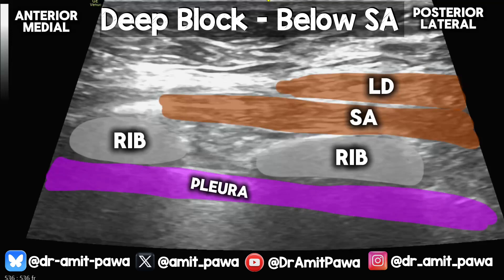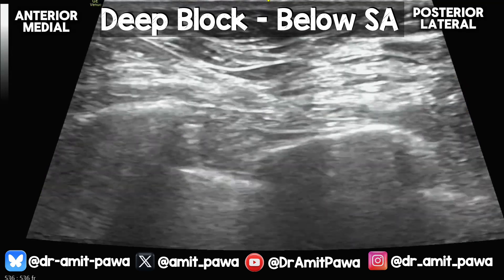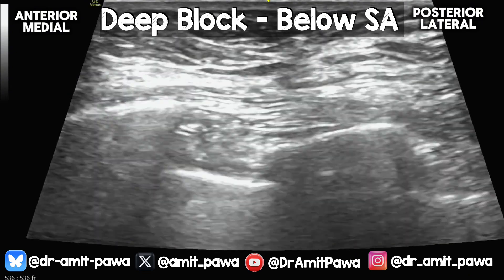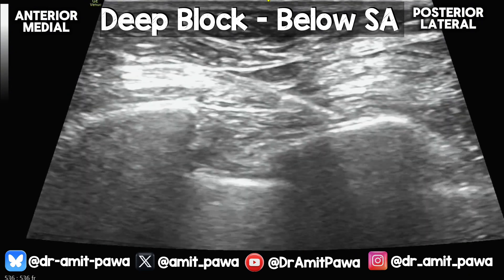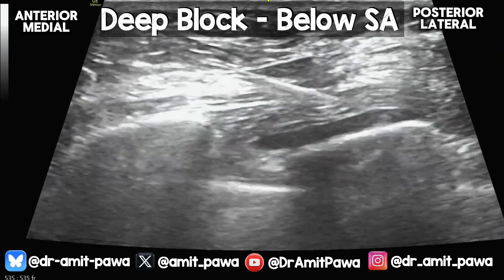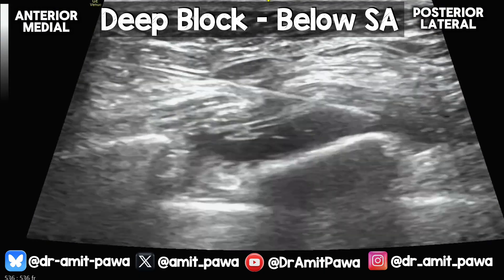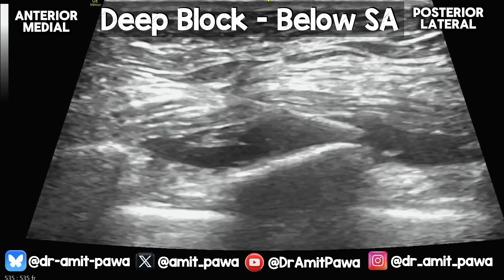Now for the deep block. The patient is lying supine with the arm abducted, and the needle comes from anterior to posterior. We use the rib as a stopgap. The needle pops through skin and tissue, goes through the anterior part of LD, makes contact with the rib, and aims to lift serratus anterior up and out of the way. The first injection is a bit intramuscular, then going slightly deeper, you can see serratus anterior lifting up and out of the way. Hydrodissecting into that space and passing the needle further back, the muscle lifts right out of the way. That's a deep serratus anterior plane block.